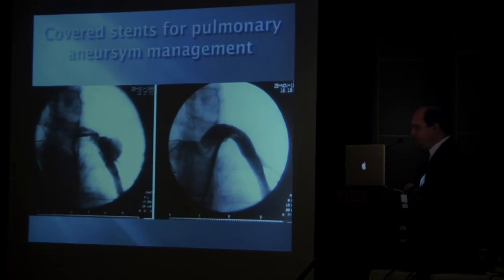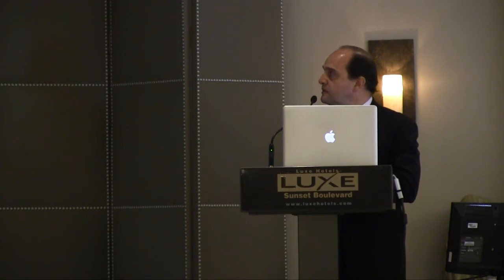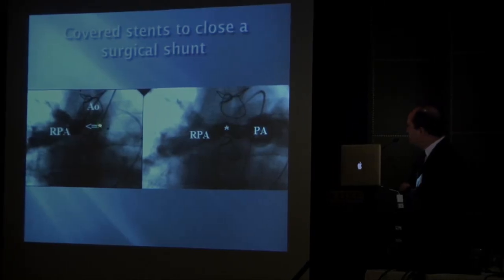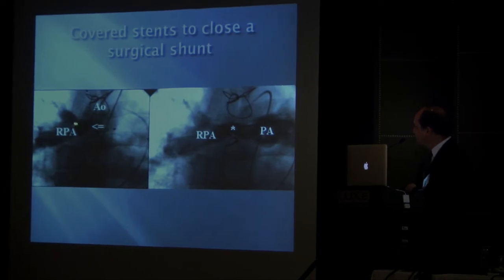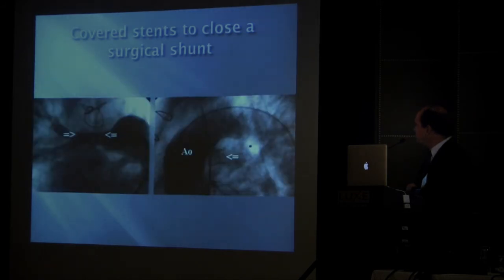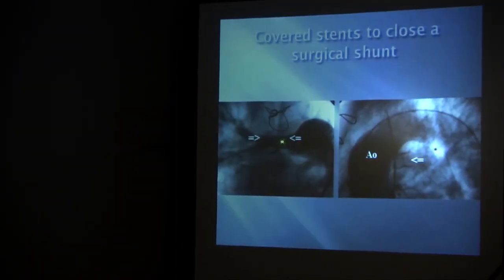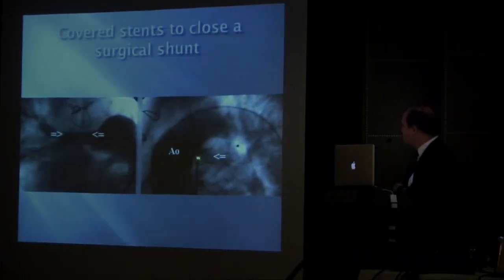This is a covered stent used to treat an aneurysm in a pulmonary artery. And this is an example of a covered stent used to close a Waterston shunt. On injection into the aorta, you can see contrast filling the pulmonary artery. This is the injection into the pulmonary artery showing the area of stenosis where the shunt is anastomosed. After the covered stent is placed, it relieves the obstruction, and on the aortic injection there's no further flow across to that pulmonary artery.